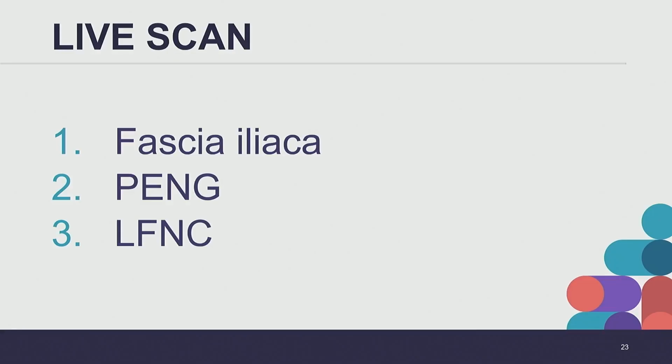All right. So Dr. Burnett's palpating for the ASIS right now to get that suprainguinal fascial block. And you can see on the screen the position of his probe is sagittal, just medial to the ASIS. And we'll show that one more time.